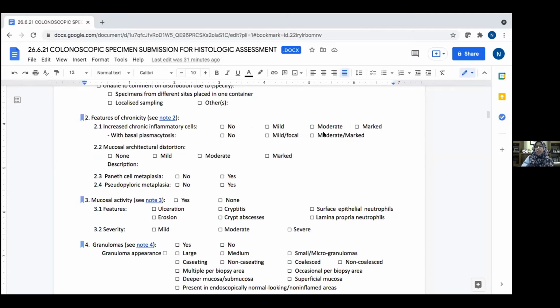It's kind of subjective, but I always say that you always compare with, keep some normal slides of bowel mucosa or bowel resection specimens close by, so that you can always go back and refer to. You have one of right side and one of left side, so that you can compare objectively.